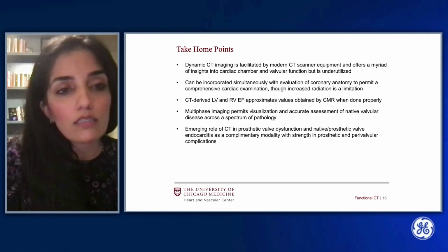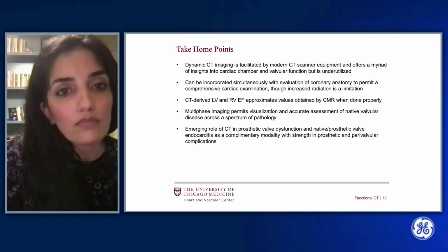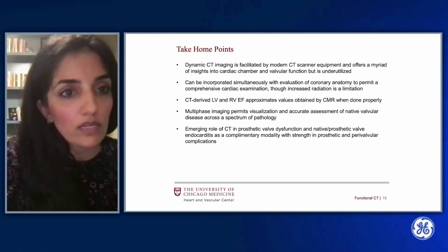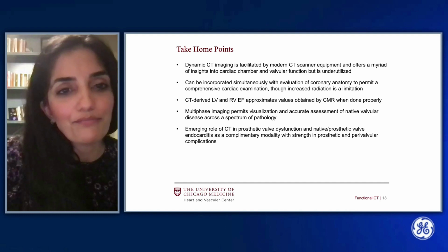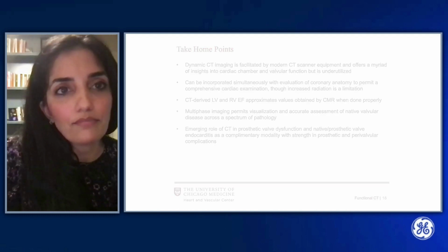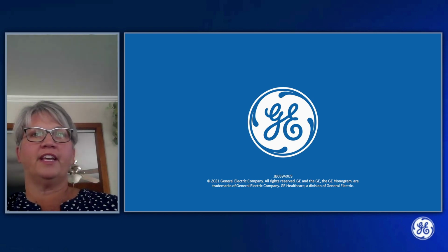And lastly, there is a real and promising emerging role of CT in prosthetic valve dysfunction and native and prosthetic valve endocarditis as a complementary modality, with particular strength in prosthetic and perivalvular complications.